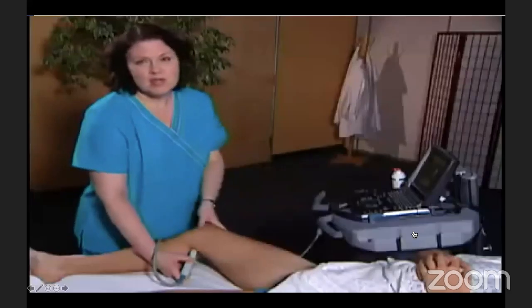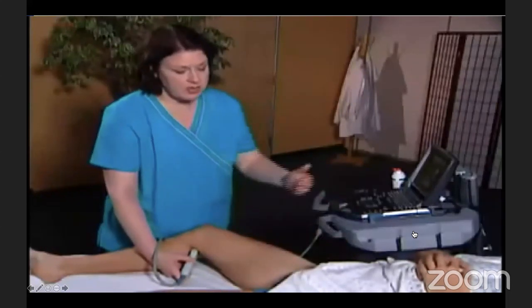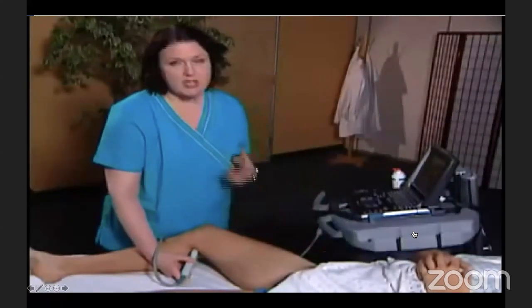Those are the two steps for assessing the leg for deep vein thrombosis. It's just these two evaluation points, but just make sure that you evaluate each area thoroughly and you do your compression technique completely. So this is a quite concentrated and focused assessment into 2 points, either common femoral and throughout the superficial femoral vein until popliteal vein, using only one mode, which is the B mode or brightness mode, some people like to call it, and compressibility. But a traditional one, and the one we want you to do, is B mode and color mode and spectral waveform throughout the lower limb.